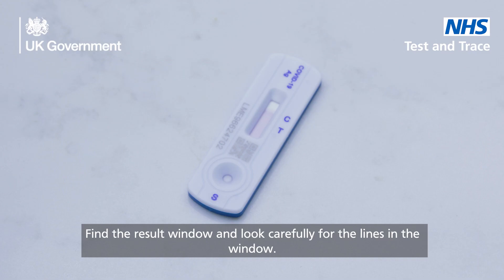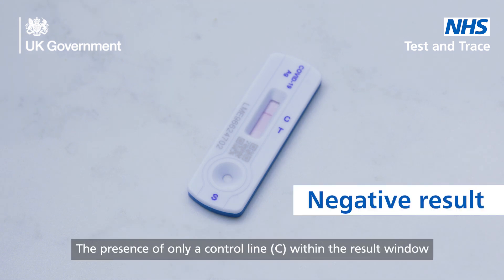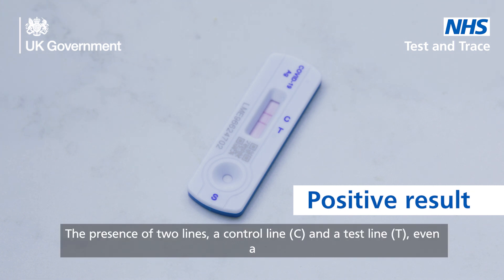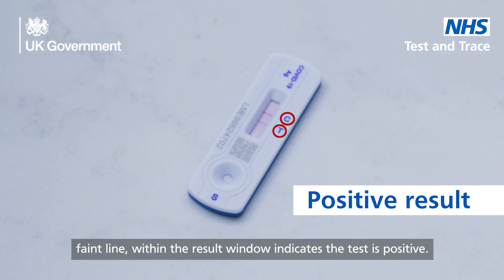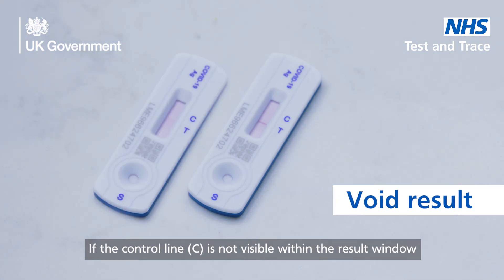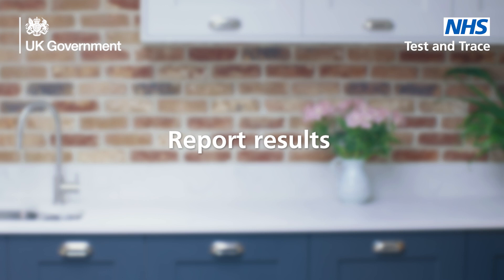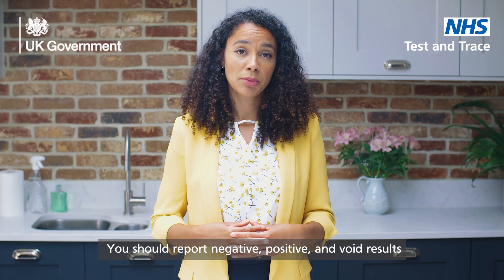Find the result window and look carefully for the lines in the window. The presence of only a control line C within the result window indicates the test is negative. The presence of two lines — a control line C and a test line T — even a faint line within the result window, indicates the test is positive. If the control line C is not visible within the result window after performing the test, the result is considered void. If you get a void result, you must perform a new test.